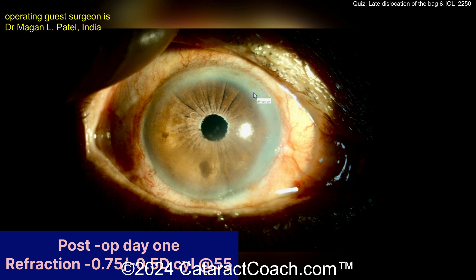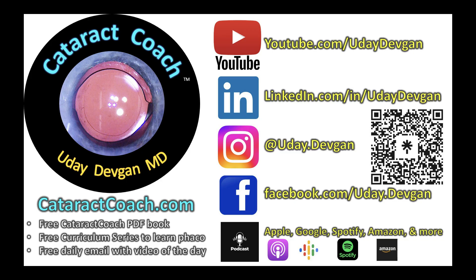Looking at the postop pictures — beautiful centration, a nice result. You can still see all that pseudoexfoliated material at the pupil margin on the postop picture. The nubbins look reasonable. Very nicely done. Check out our podcast — every week a brand new podcast teaching the secrets of ophthalmology, with incredible guests sharing secrets for success.